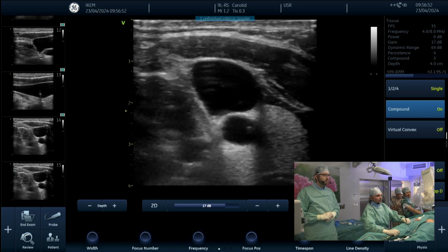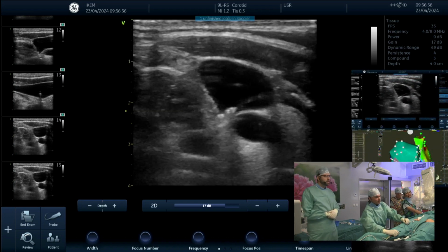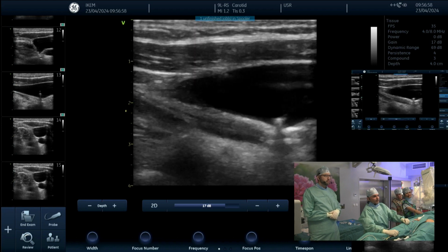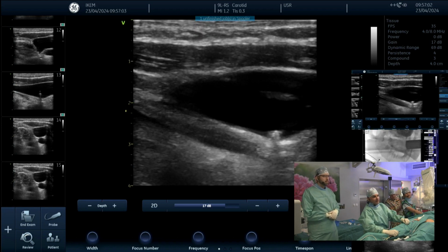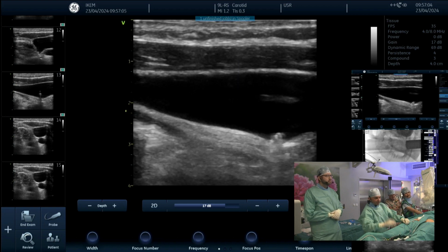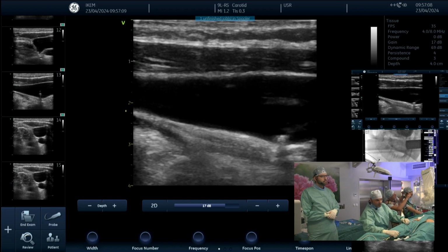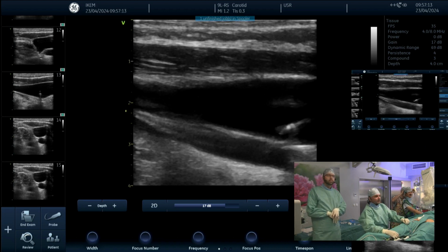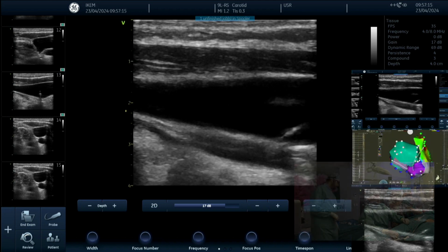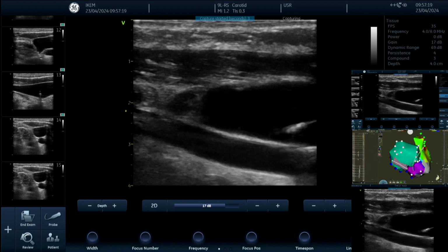Great, great. And can we see the long axis view as well? Yes, great. You can see a good contact between tissue and the catheter, which also touches the vagus nerve, which is below the wall of the vein. So we can also pace now from the right. I'll just store this because this is a very nice view.